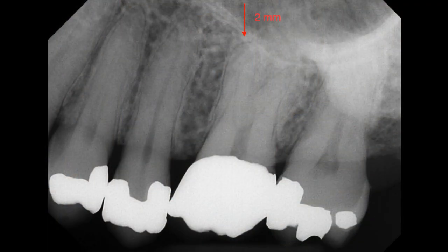For the molar periapical, capture the full length of the crowns and roots along with the distal of the most posteriorly erupted tooth and tuberosity region. Also capture 2 millimeters of bone past the root apex and open the contacts.